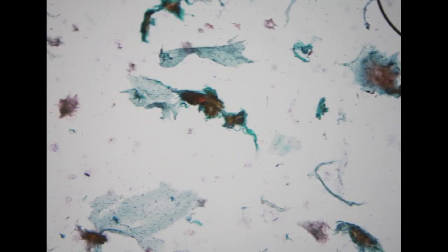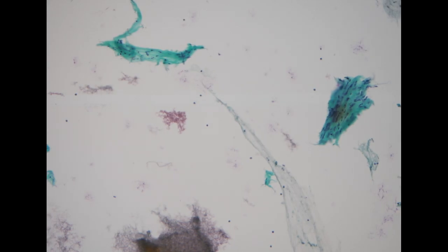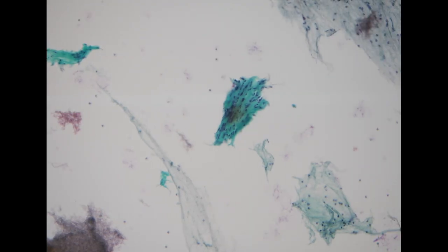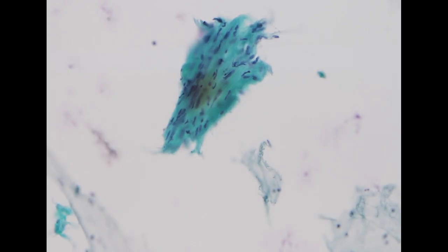The next specimen is from a 67-year-old female with a right neck mass. So usually when we receive the requisition sheet, sometimes they only write neck mass. So then there are so many different possibilities for a neck mass. It can come from a lymph node, from thyroid, from salivary gland, from soft tissue. And it can be solid and it can also be cystic. So you definitely need to check more details if the neck mass is the only information that we have.